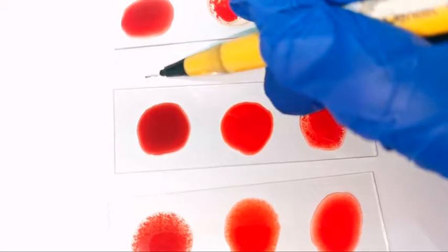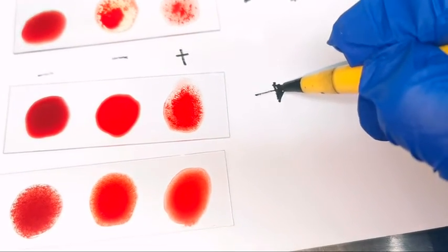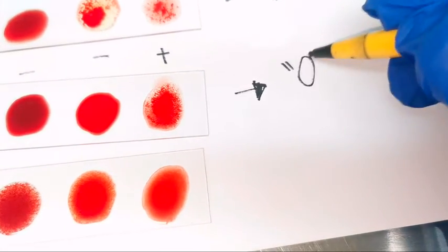In the third slide there is clumping only on the drop of blood with anti-D. There is no clumping on the drop with anti-A and anti-B. Therefore the blood type is O positive.